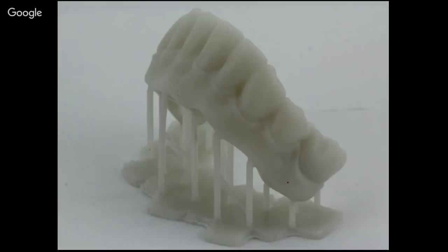So right now, if you've done hybrids, it's a very costly lab bill to have some kind of a temporary restoration to deliver right after you do, let's say, an all-on-4 procedure, right? And again, no fault of the lab. It's very time and material intensive. So we want the lab or the doctor to be able to set these teeth to generate the digital try-in or hybrid or whatever, and then to be able to 3D print or mill that out, and that creates their temporary restoration.